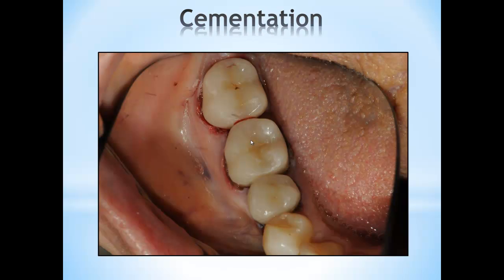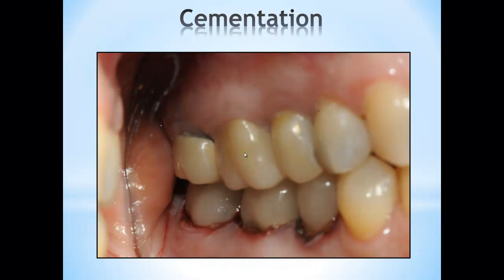So let's go with another image. Again, I prepped my teeth and developed the restorations on numbers 29, 30, 31. I cemented them with NX3 bonding agent, and I used Unicem 2 as cement. And this is the buccal view of the restorations.